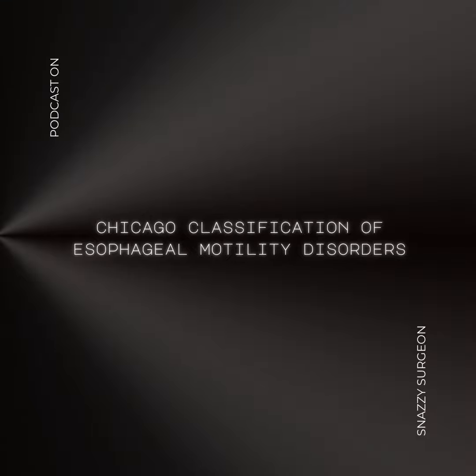Well, one we see pretty often is distal esophageal spasm. You might remember it used to be called diffuse esophageal spasm, but the Chicago classification has updated the terminology. Right, so DES is now distal esophageal spasm. What are the telltale signs on HRM that help us diagnose this? The key findings are, first, a normal median integrated relaxation pressure. That means the EGJ is relaxing properly when the patient swallows.